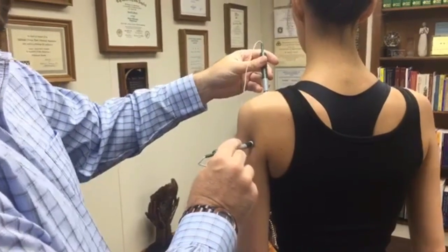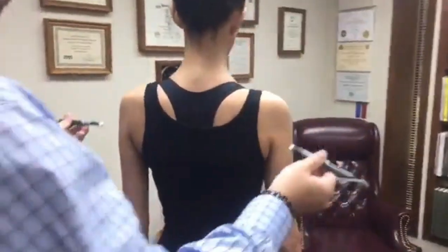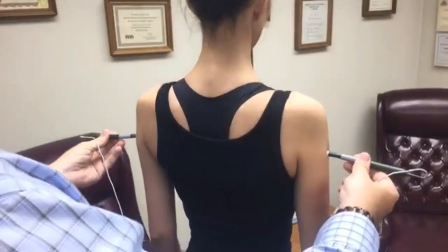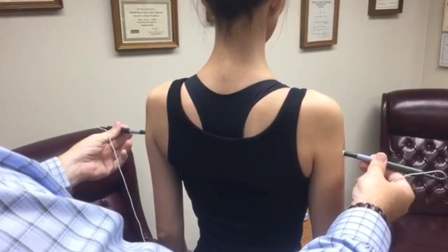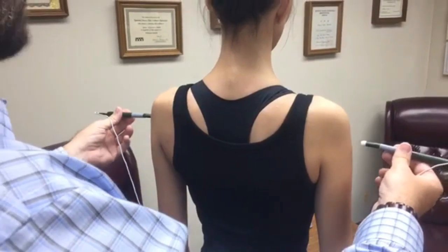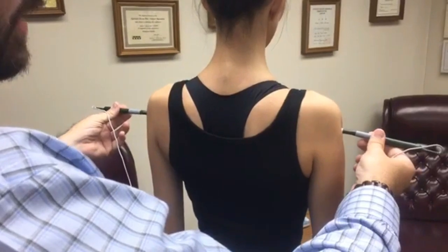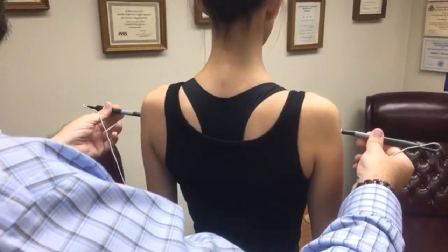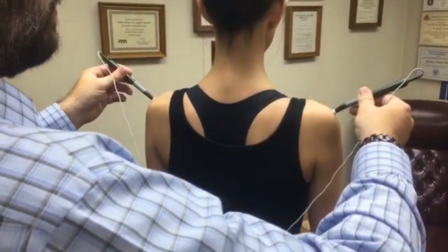The last step is connecting the two sides. One easy way, because we have skin access here, is just to go laterally right across — walk right up her shoulder, 10 seconds. Now the current in this case is going across the spine, which is the really important step. In any protocol, we want to go across the spine to bring in the central nervous system. We treat peripherally, but even if it's an ankle or a foot, we want to go from foot to foot across the spine to bring in those nerves as well.